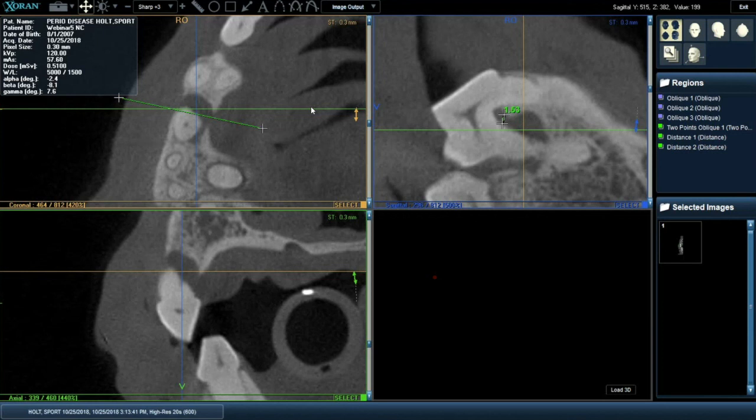But most people will image, diagnose, and treat all at once because of the convenience of having the patient under general anesthesia, and the ability to do the CT within about a minute or two, relatively quickly.